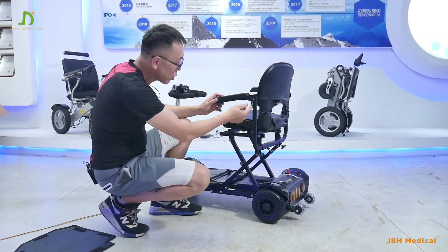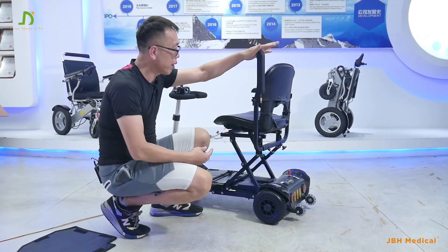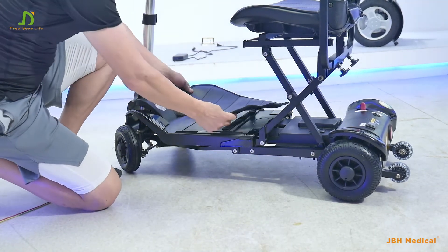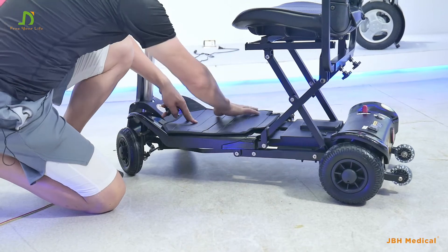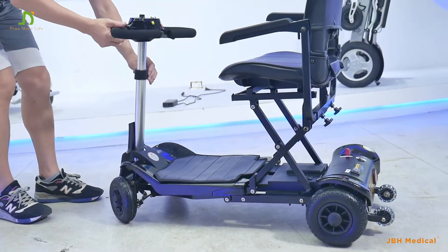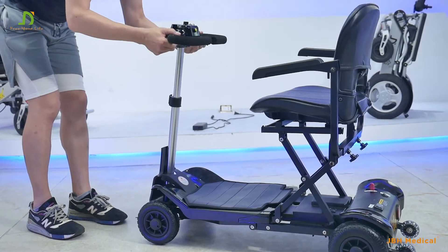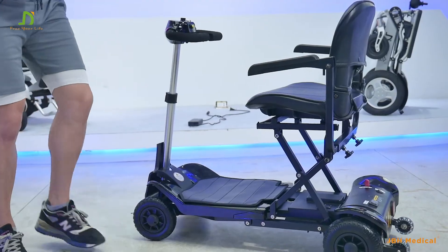You can also adjust the angle of the armrest. Let's put the foot pad here — attach it on. Then we can adjust the suitable length of the handlebar, up and down, and then lock it. We are ready to go.